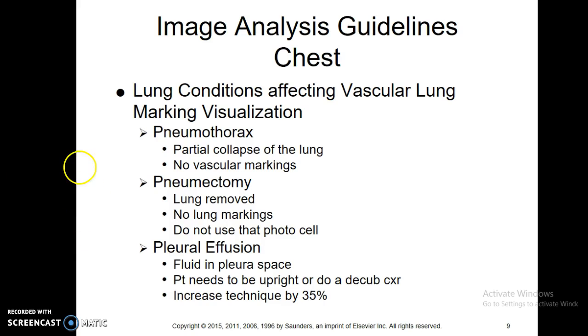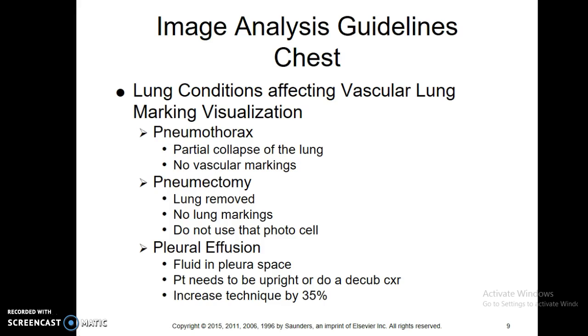Pneumothorax — we're going to cover that a little bit. We talked about this earlier in the first semester. Basically it's just a partial collapse of the lung. No vascular markings are going to be seen when you have that collapse of the lung, basically just because you have a giant air pocket in your lung.